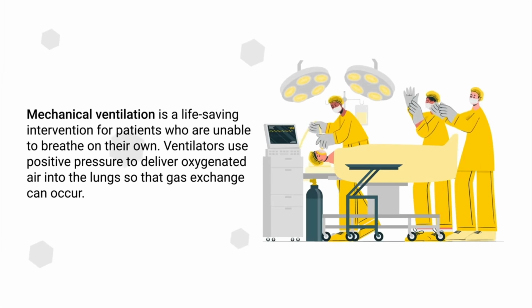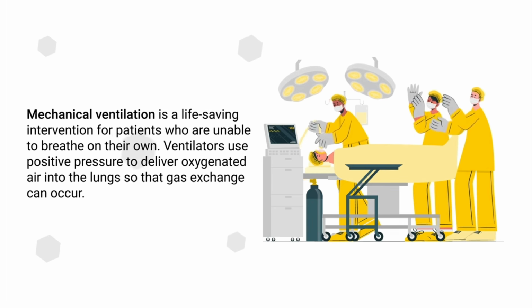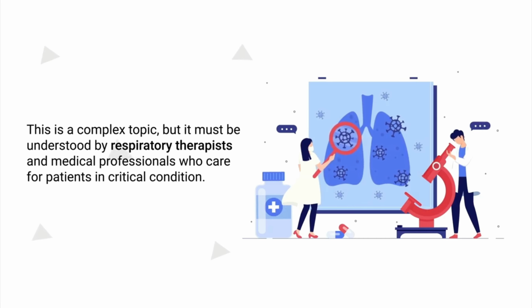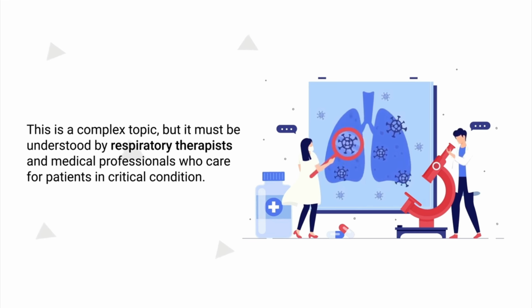Mechanical ventilation is a life-saving intervention for patients who are unable to breathe on their own. Ventilators use positive pressure to deliver oxygenated air into the lungs so that gas exchange can occur. As I'm sure you are aware, this is a complex topic, but it must be understood by respiratory therapists and medical professionals who care for patients in critical condition.